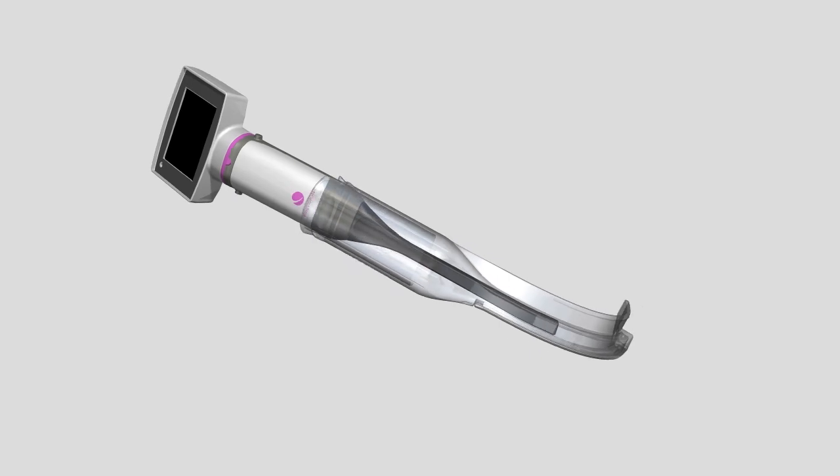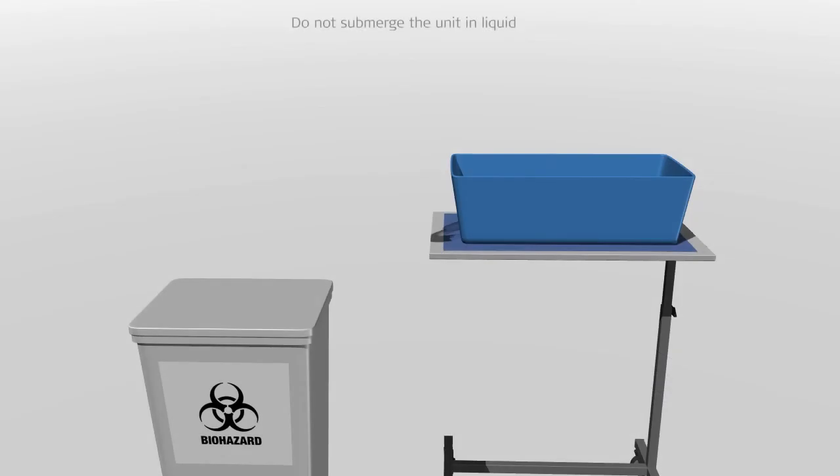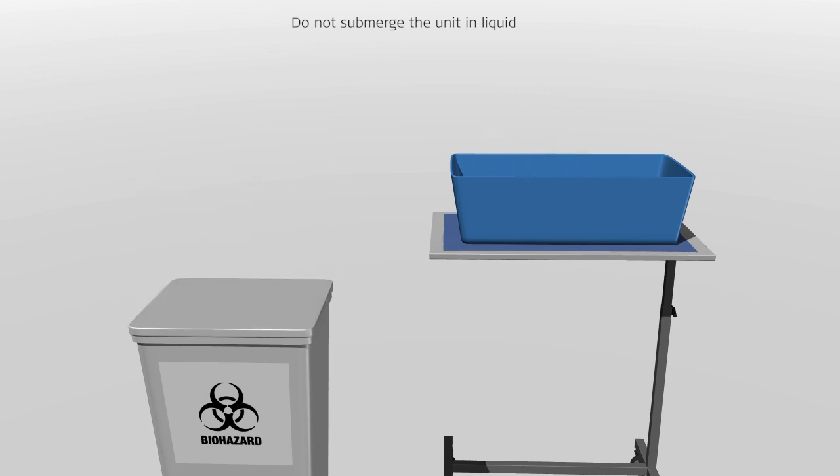After completion of any procedure, separate the display and video adapter from the A blade and dispose of the blade following local guidelines. Disinfect the display and video adapter. If the display or adapter are visibly soiled or suspected to be contaminated, proceed to the advanced cleaning steps outlined in the KingVision A-Blade Video Laryngoscope Instructions for Use found at www.ambuusa.com.